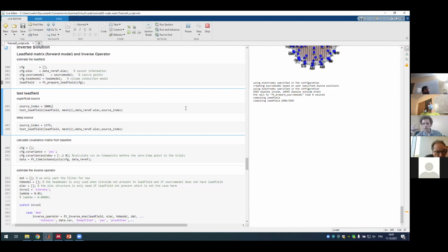If you have a very sparse representation of your sources, some regions won't have sources, and therefore you can't do any correspondence between patients, because you may miss some regions. So it's important to have enough source points to be able to reconstruct all the regions you need.